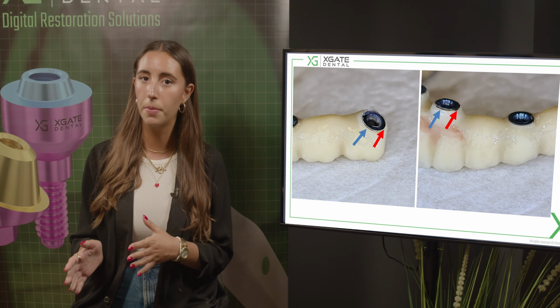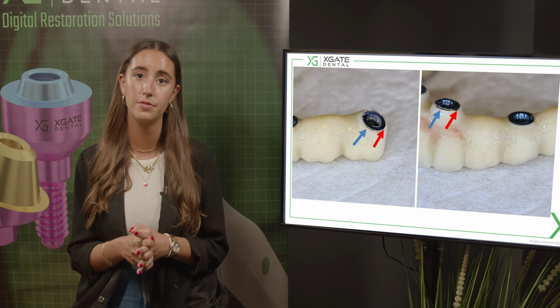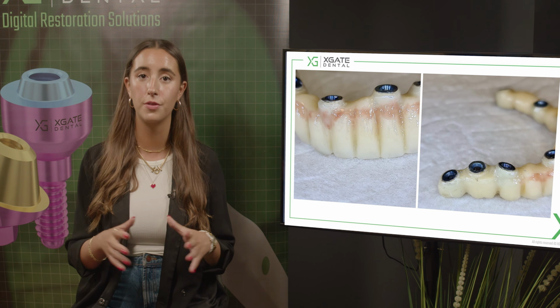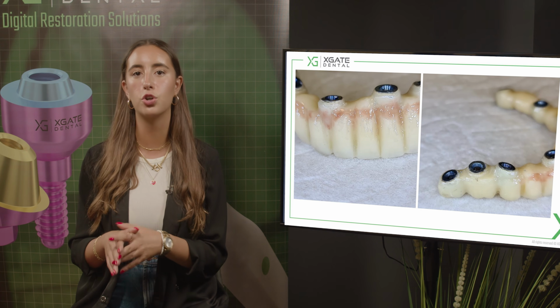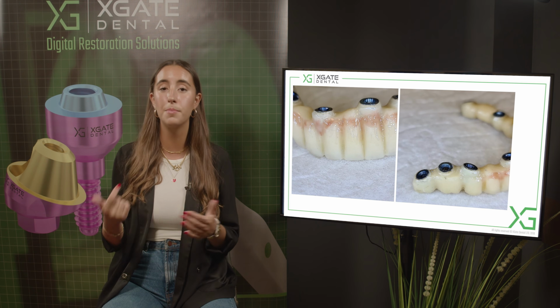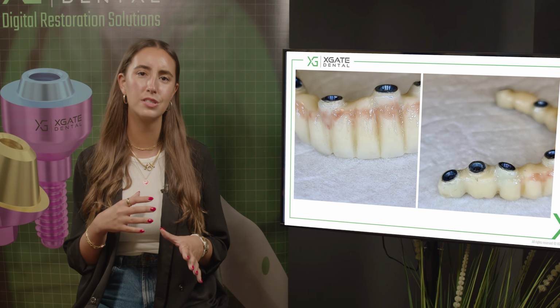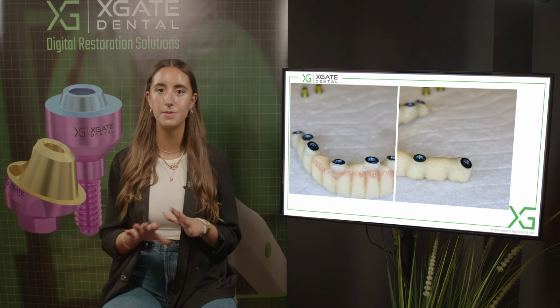You can just close it with composite material, the same flowable composite used for tooth filling. So it would go inside the slot, and then you just polish it and you have a perfectly fine full monolithic zirconia bridge. You know that when you screw the zirconia bridge, you won't have any internal forces, because the cement didn't harden during the cementation process. So the sleeves are perfectly passive. They compensated for those inaccuracies and those internal forces that could have been. That's all. You have 5 zirconia bridges with no gaps, nothing at all.